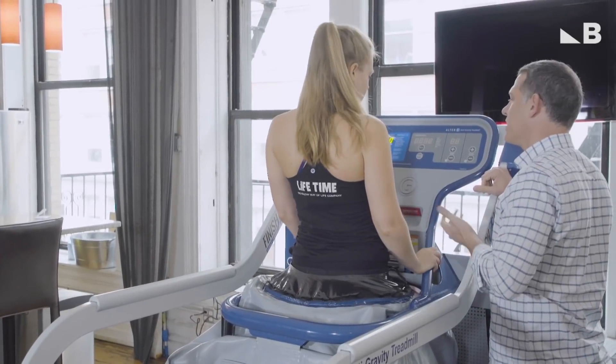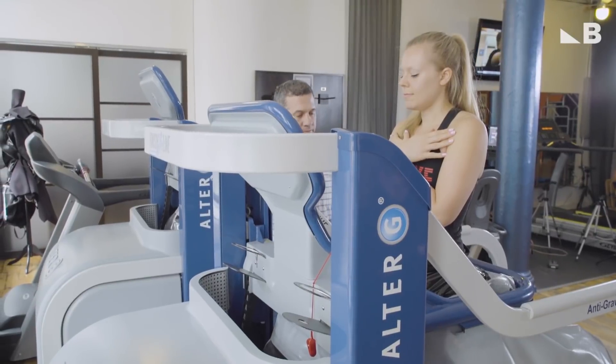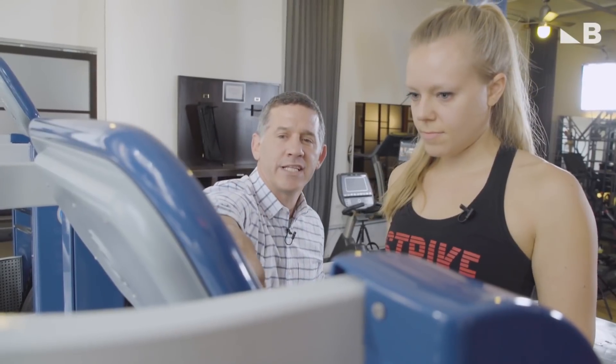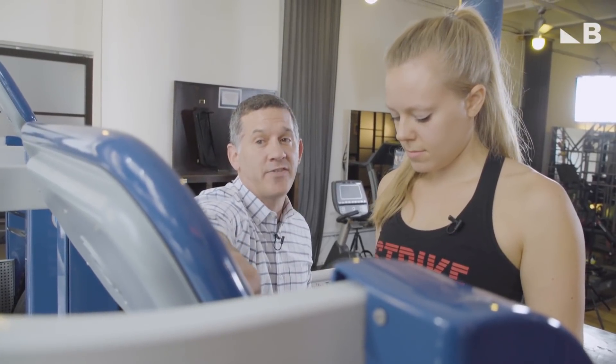The next thing we're going to do is turn on the machine — it's going to calibrate your body weight. Once she's on the treadmill running, I want to know that she's feeling 100% pain free. What we'll do is take this down 30% — if you weigh 100 pounds, now it's as though you weigh 70 pounds.